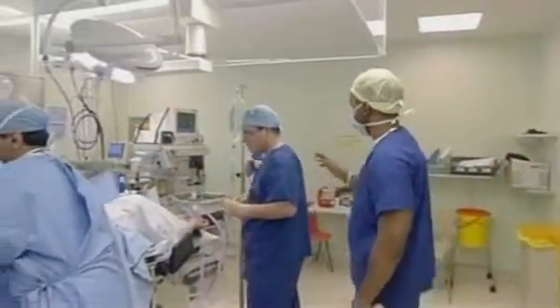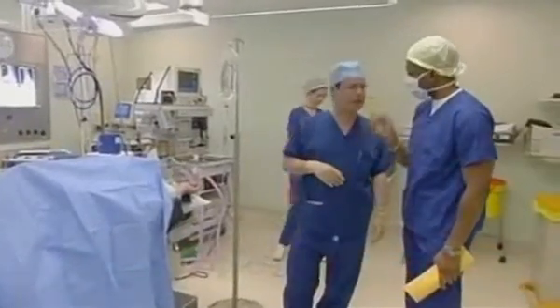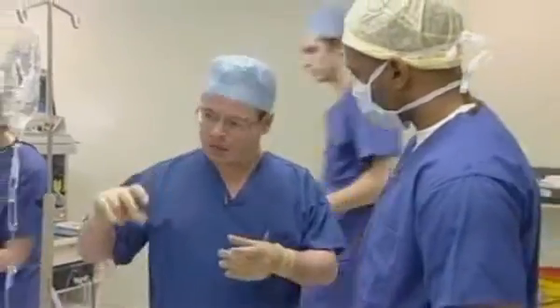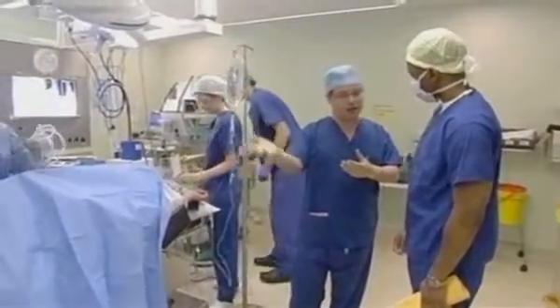If I can just have a quick word with your good self, Joseph. You did something quite different for Steve, didn't you? Something called nerve blocking, I understand. We have, yes. So what exactly is that? Well, we have anaesthetised the nerves that supply the leg. Basically, there are 2 major nerves, the femoral nerve and the sciatic nerve, which run along the groin. And I place local anaesthetic. I use a bit of specialised kit which generates electrical activity. So I place a needle close to the nerve and turn the electrical currents gently up and cause the nerves to get excited and then contract the muscles.